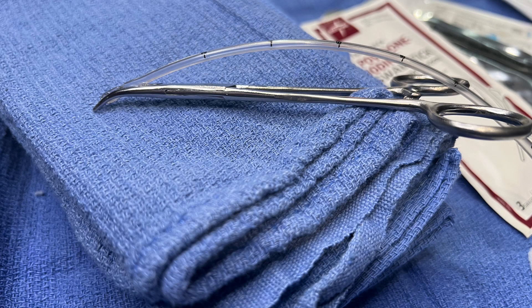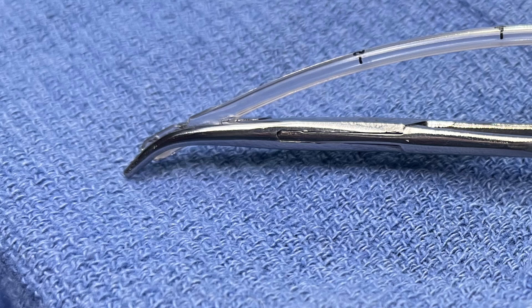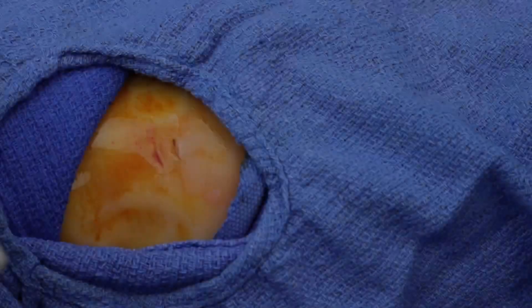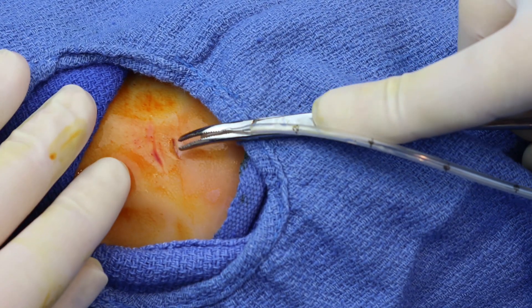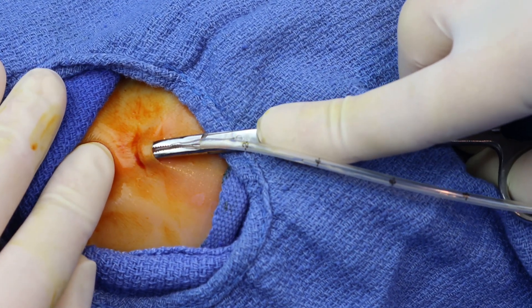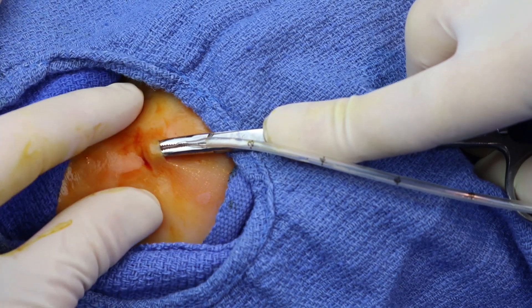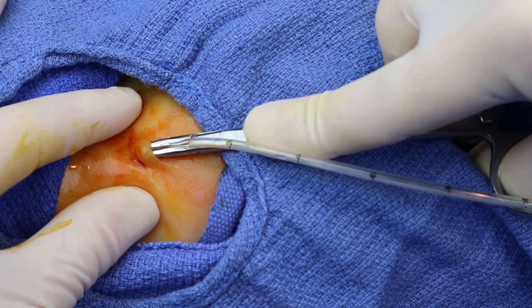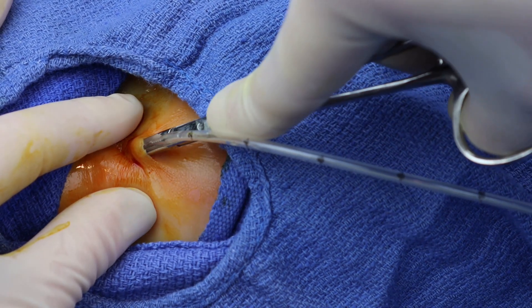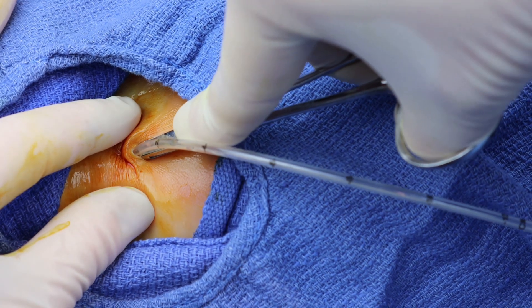With the trocar removed, you will place the chest tube in the curved hemostats, as shown here. It is important that the chest tube is not past the end of the hemostats, so that they can be used to easily punch through the fascia, muscle, and pleura. Now, with the chest tube clamped within the closed hemostats, enter the previously created hood and advance to the top of the next rib while parallel to the chest. Next, tilt the hemostats to a 45-degree angle. When you do this, punch through the musculature into the pleura using pressure on top of the curved hemostats.